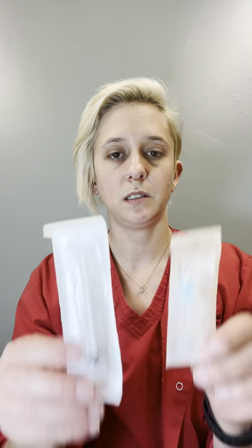First we're going to start with some alcohol wipes, then you're going to need your needle and syringe, your medicine, and a band-aid. I usually tell people to clean the area you're going to be administering the shot into first, so it has time to dry while you're doing the rest — more time efficient. If something touches that area you'll have to clean it again. You want to wait for it to dry so it doesn't sting when you put that needle in, because alcohol will sting the area.